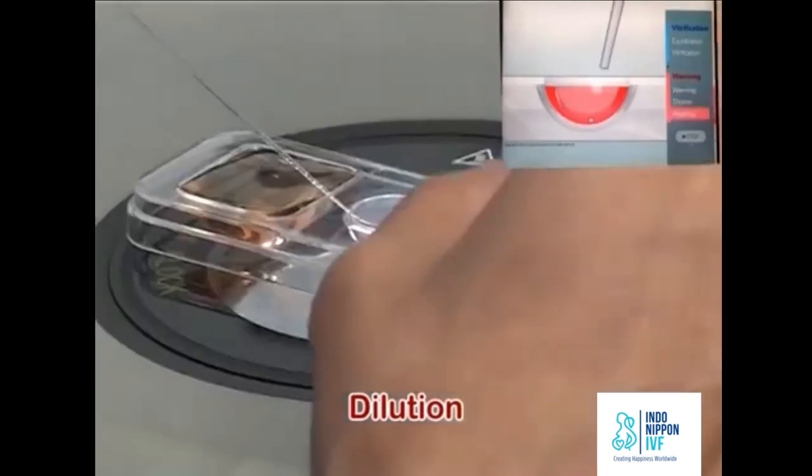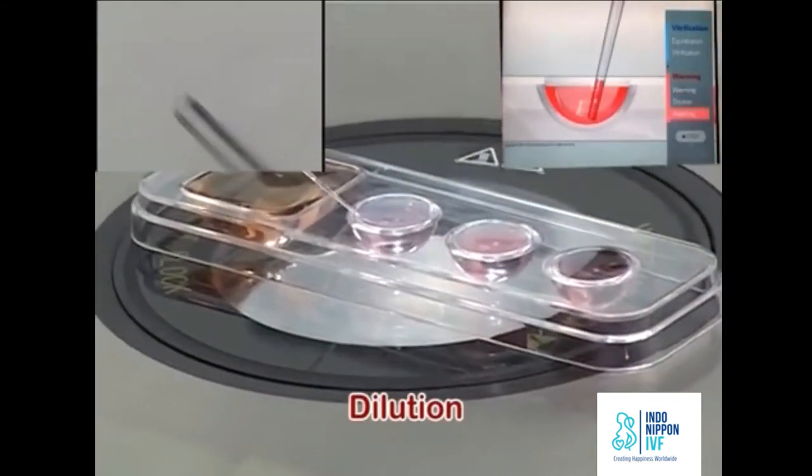At the end of 3 minutes, aspirate the oocyte and 3 mm long of DS into the pipette.